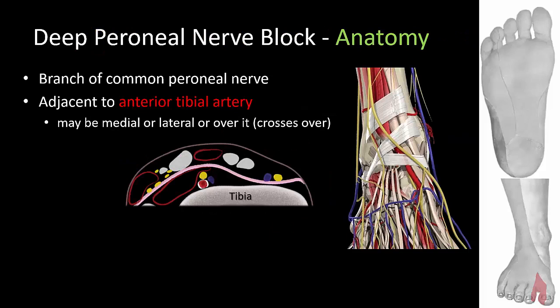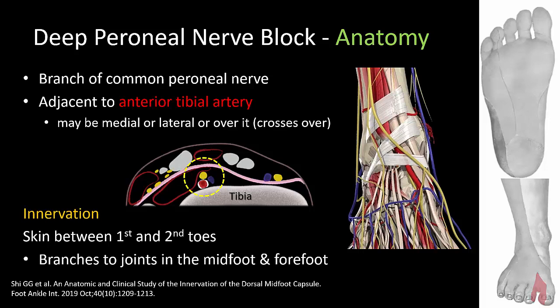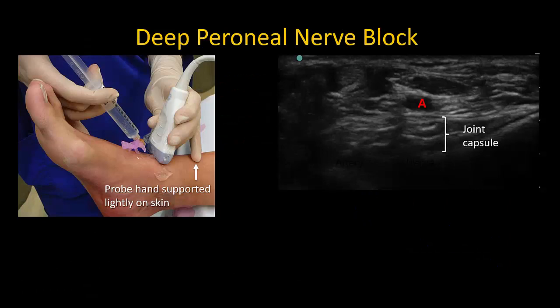The deep peroneal nerve descends over the anterior aspect of the tibia and lies adjacent to the anterior tibial artery, which becomes the dorsalis pedis artery in the foot. The artery is the primary landmark, and the nerve may be medial or lateral or even lying on top of it depending on the level at which the nerve is imaged. It innervates not only the skin between the first two toes but also deeper structures in the midfoot and forefoot. The probe is placed over the anterior aspect of the tibia and scanned in a superior to inferior direction.